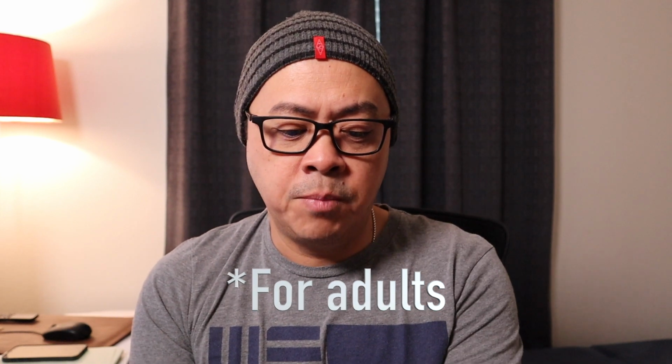This is actually a combination sensor and transmitter. The DEXCOM G6 had a separate transmitter, which wasn't really a big deal. You popped on the sensor, you popped on the transmitter on top of it, and away you go. I still have the DEXCOM G6 on me, and we're going to be removing it, but I just wanted to show you. I think, for the most part, wearing it on my arm seemed to work better. Now, with the DEXCOM G7, they do recommend you use it on your arm. So I'll probably start with the right side and then move it back and forth between the left and the right.